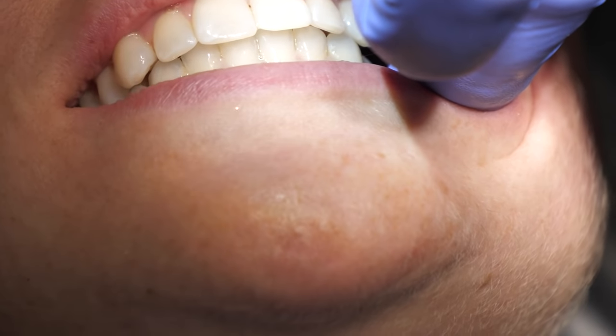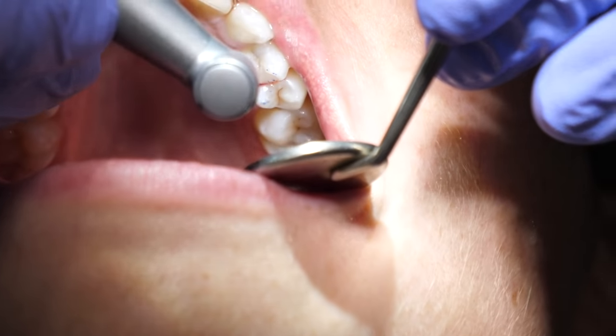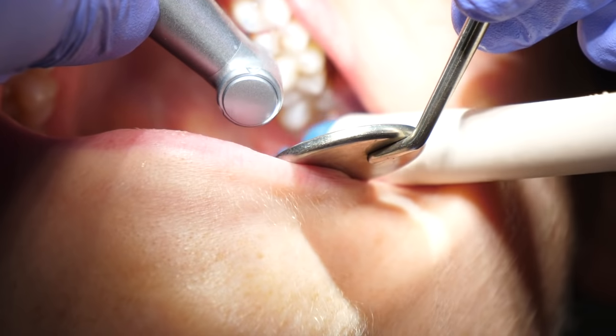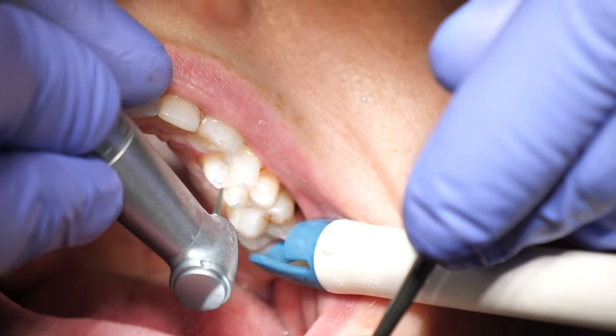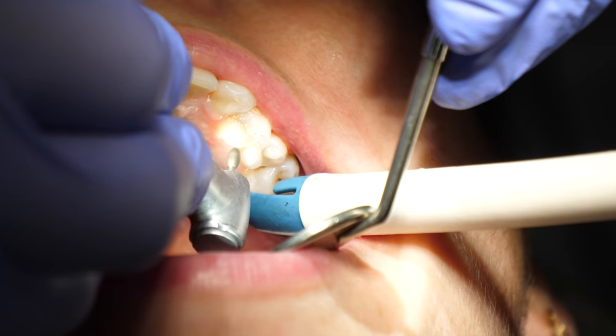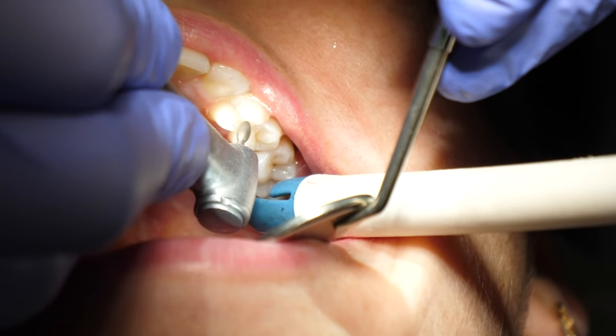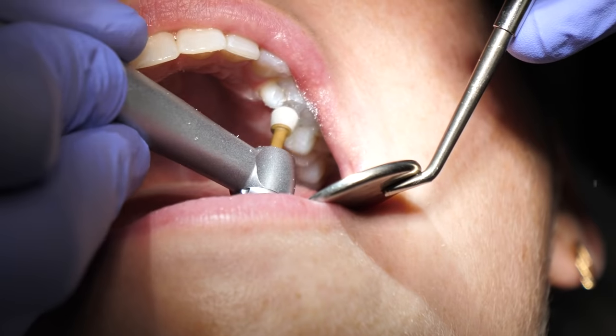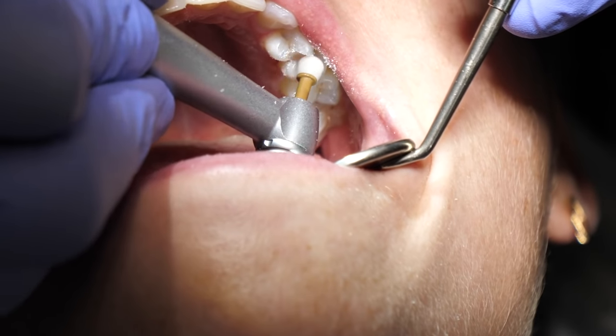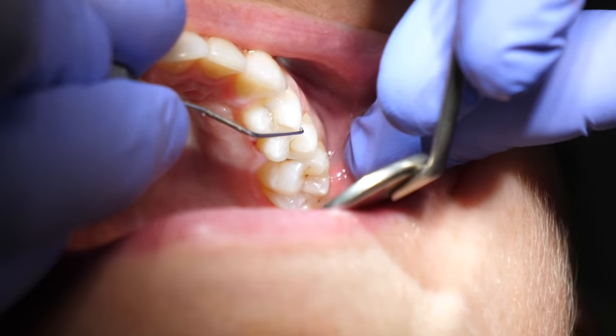Sometimes it's difficult for the patient to tell for themselves if the filling is too high or not because you're numb, right? So this paper helps the dentist see if your bite is looking too high or not. If it is too high, they will trim off the excess filling material with the high speed. They may check the contact area again with the floss, and then they will polish it so it's nice and smooth, and there's your final restoration.